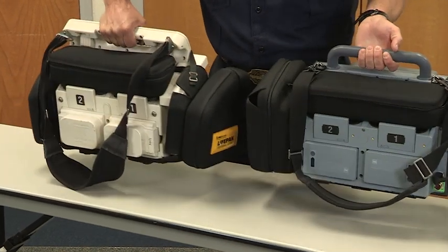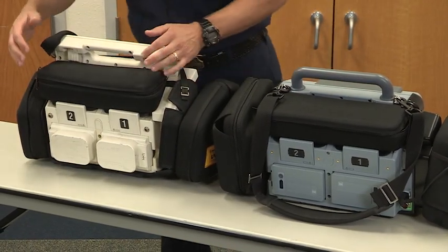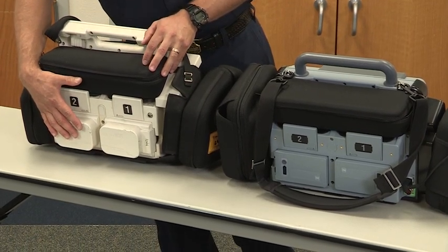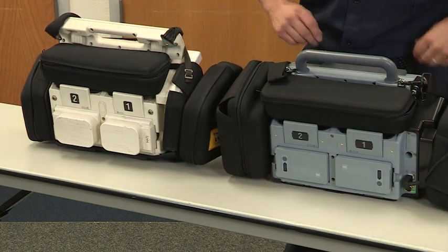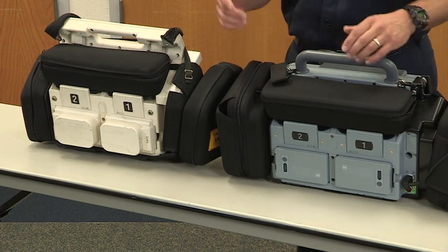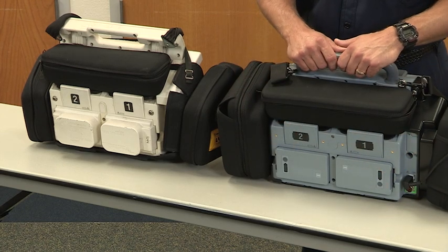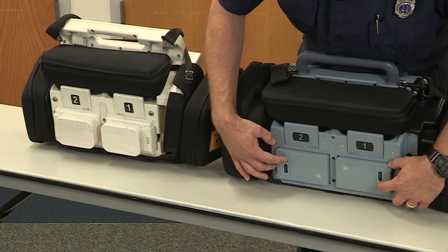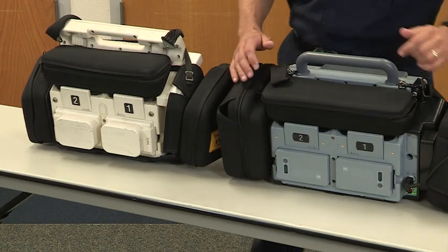Now I'm going to turn the machines around so that we can take a look at the batteries, because there's a few differences with these as well. Our current system with the LIFEPAK 12 has batteries that require an onboard charging system and a pigtail on the fire apparatus. Going to the LIFEPAK 15 with new battery technology and the lithium-ion batteries, we're going to have desktop charging systems at the stations, and we'll just have batteries on the LIFEPAK 15s that are not going to require an onboard charging system anymore. And each battery has a battery charge indicator on it. And we'll show you that a little bit later.